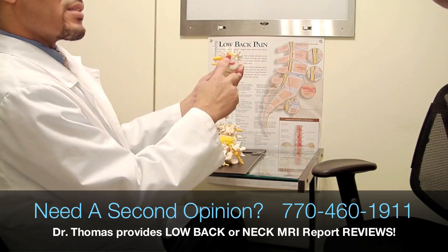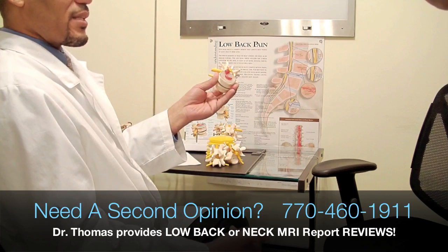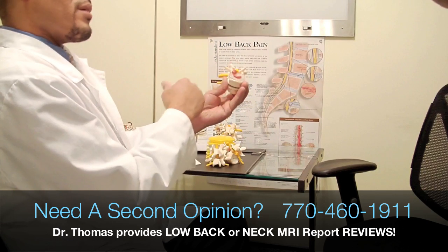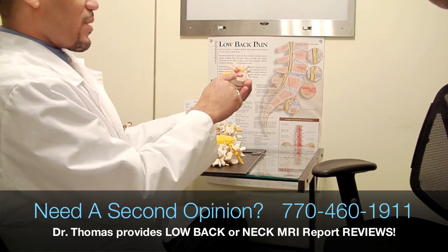And if it is, it tends to give you symptoms down both legs. Right now, you're still experiencing symptoms just down one leg? Yes. So on your MRI it shows that too, and we're going to go over it in detail to see what's what with that.